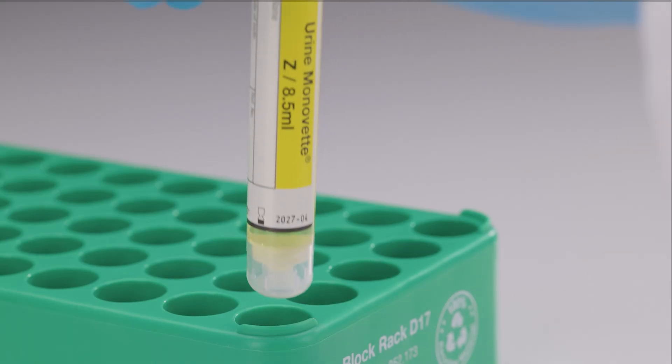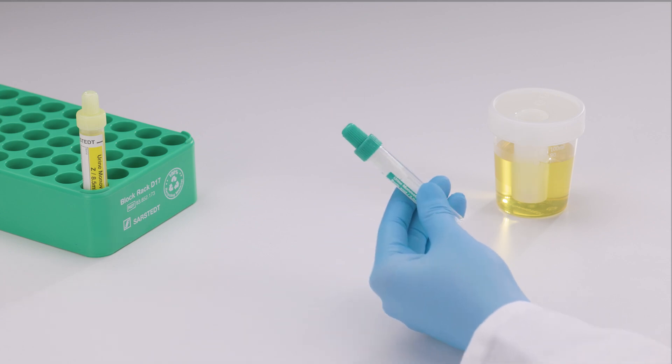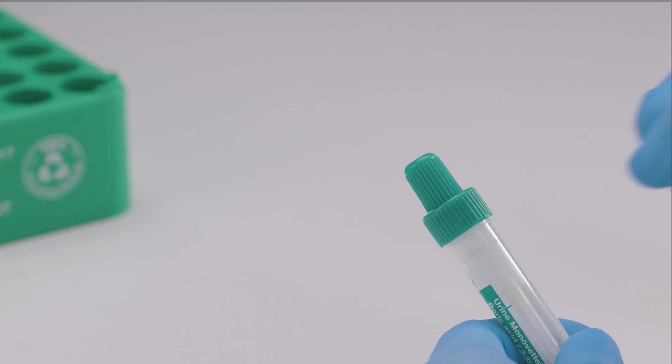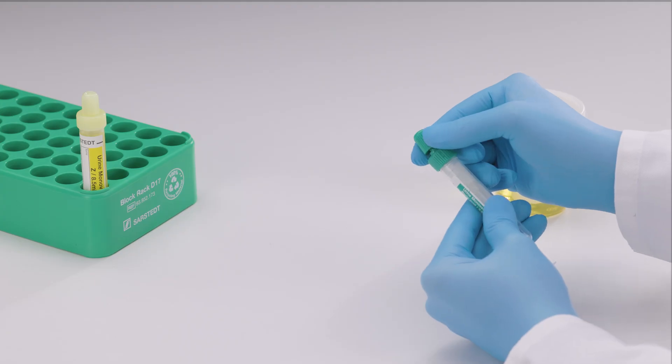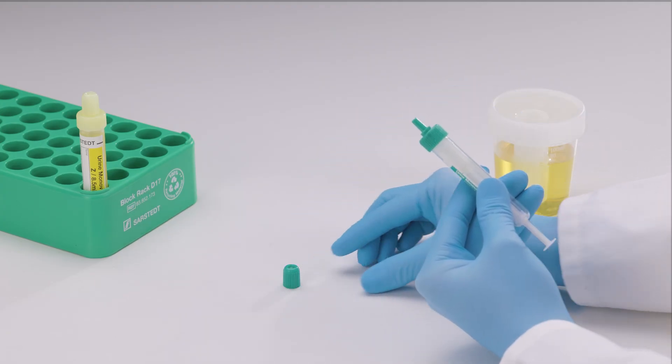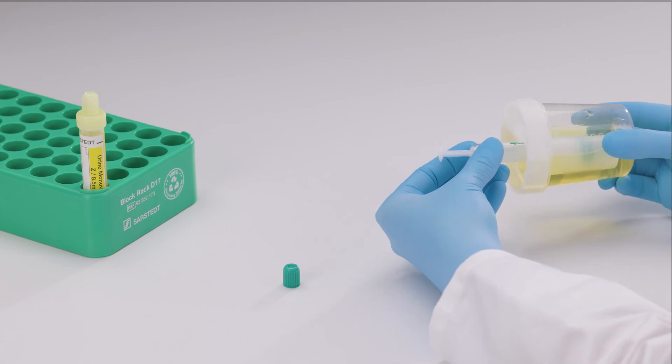If required, proceed with a urine monovette boric acid. Hold the urine monovette upright with the tip pointing upwards. Tap the urine monovette twice to settle the boric acid at the bottom of the tube. Remove the stopper from the tip of the urine monovette. Repeat the same process as previously.